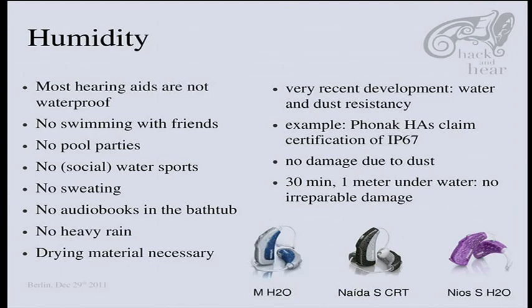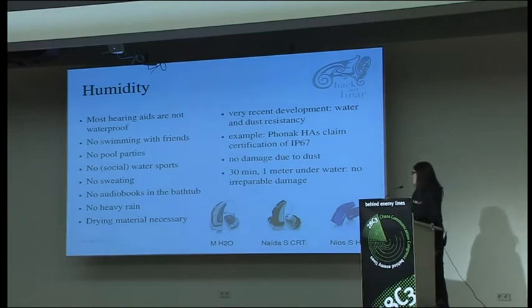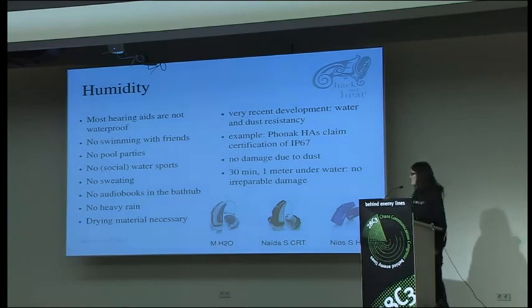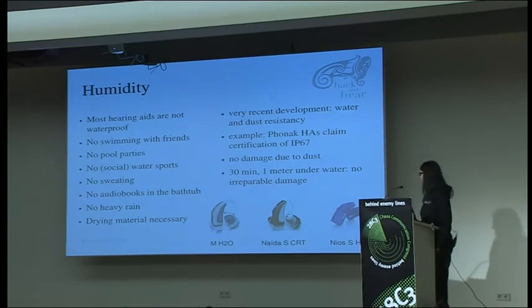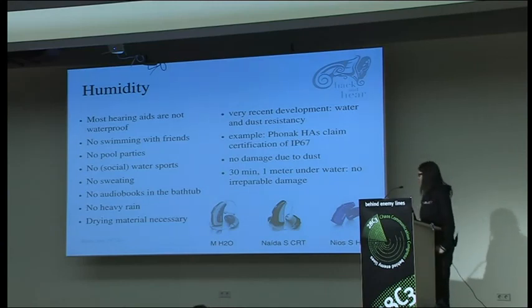A very recent development is that Phonak also offers hearing aids that are waterproof or water resistant. They claim that you can hold it underwater for 30 minutes and then there will be no irreparable damage. I'm not really sure what that means, so I guess you probably have to dry it. Or if you have to give it in for repair, for weeks until you get it back.